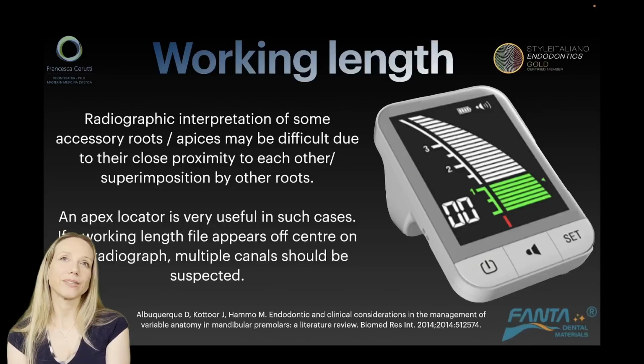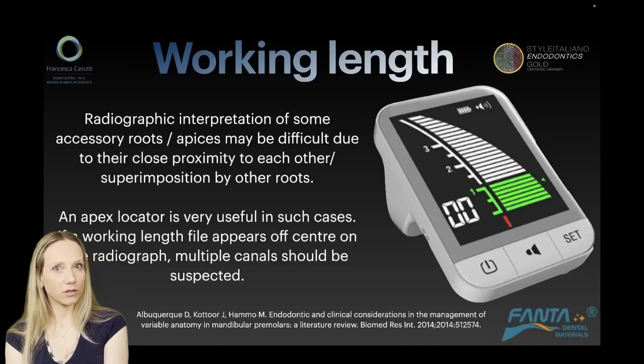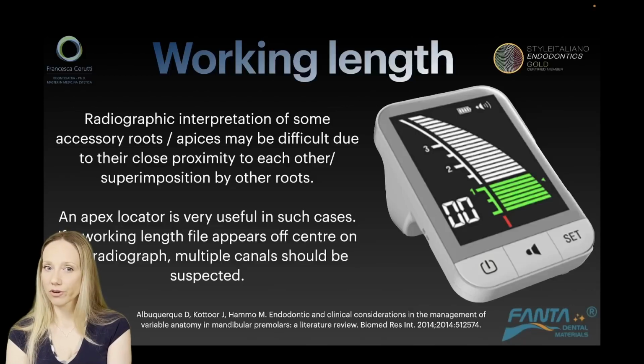And what about working length? Well, sometimes if I'm taking an X-ray, it's difficult because of the superimposition of structures to see if I am in the correct place with my files. So in complex anatomy, maybe we can trust more our apex locator than our intraoperative X-ray.